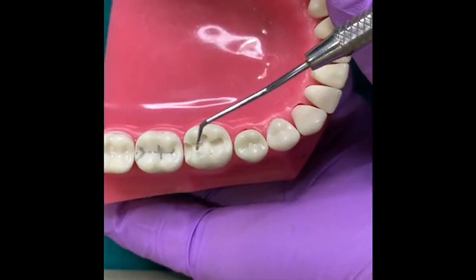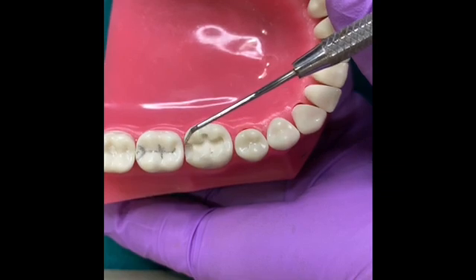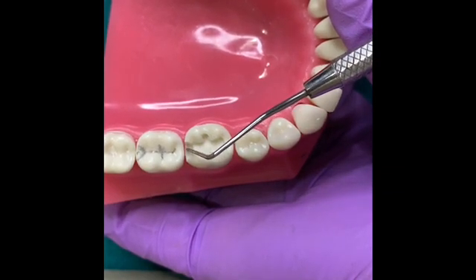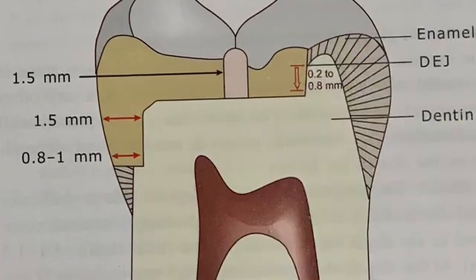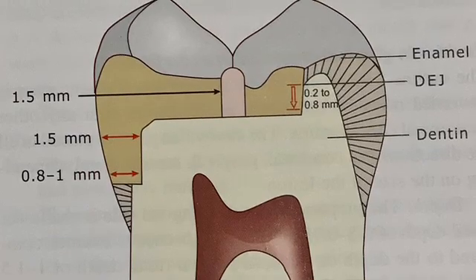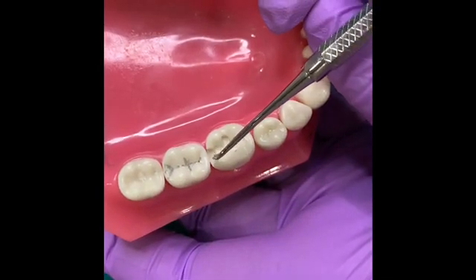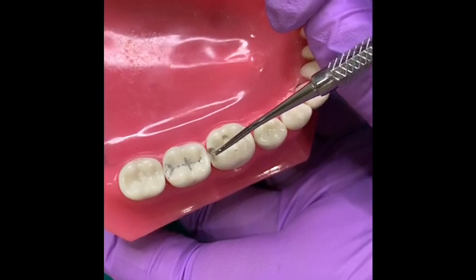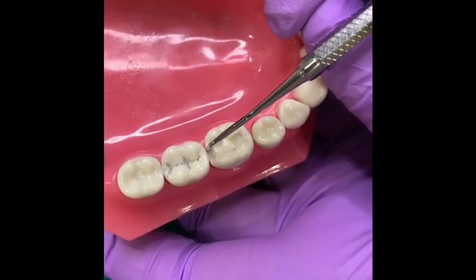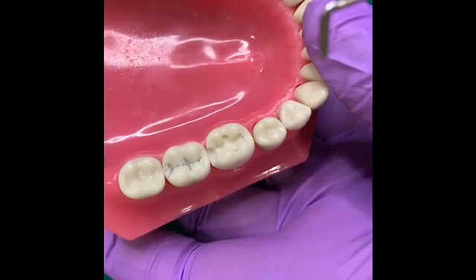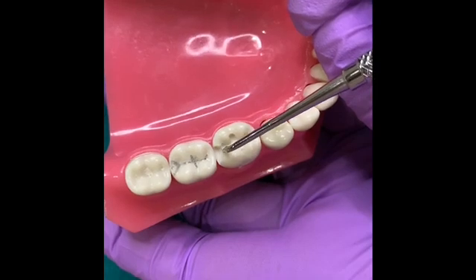In this proximal box, you can see that the buccal proximal margin is moving outwards beyond the contact, the lingual proximal margin is almost straight, and the gingival margin is clear from the adjacent tooth by about 0.5 mm. The depth of this proximal box is 0.5 mm below the contact area — these are the dimensions of an initial class 2 cavity preparation for an amalgam restoration. An enamel hatchet can be used to plane the walls and floor of the proximal box to smoothen them. Then a gingival marginal trimmer is used to bevel the gingival margin and to round off the axiopulpal line angle.